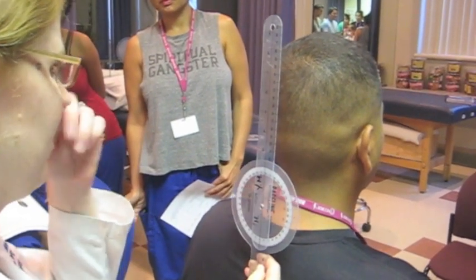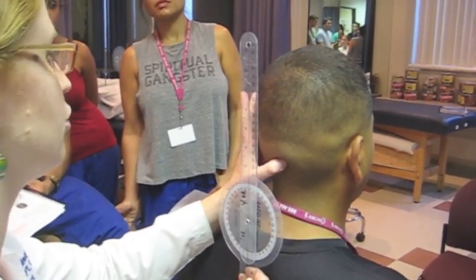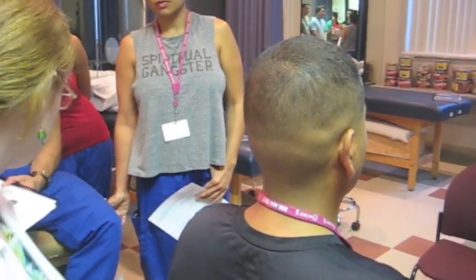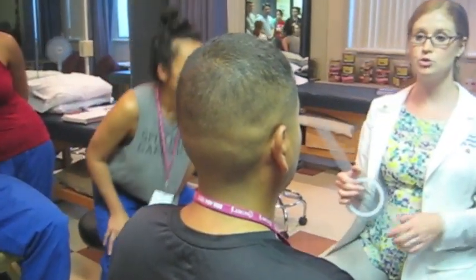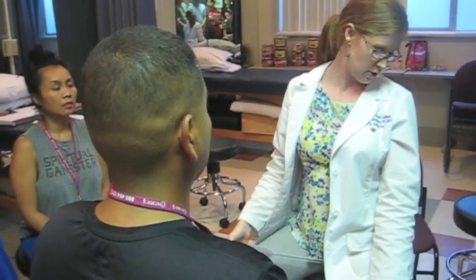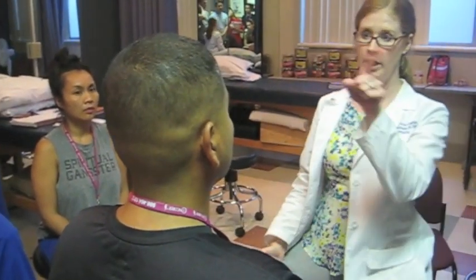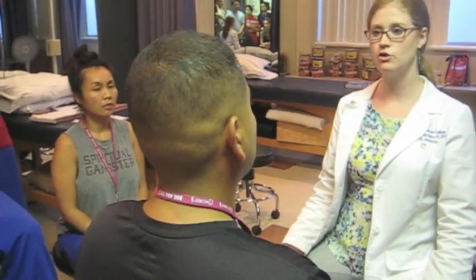The dorsal midline of the head, making sure that you're lining up with the occipital protuberance. Now before I have my patient do this, I'm going to look them in the eye and explain what we're going to do. What I'm going to have you do is tilt your head and drop your ear towards your shoulder, but careful not to let your head rotate — keep your nose pointed straight ahead. Go ahead and drop towards your right ear. Good. And come on back. And towards your left.